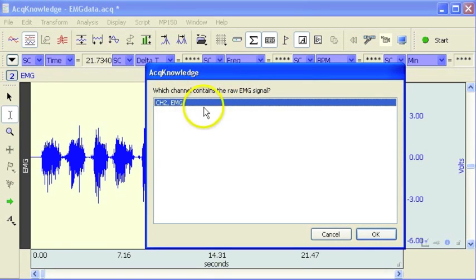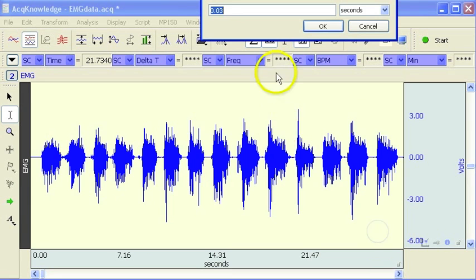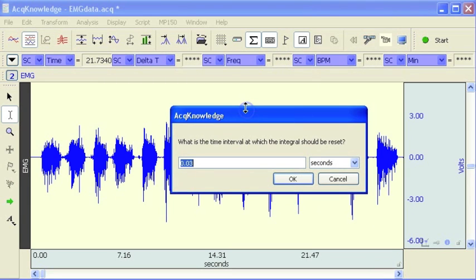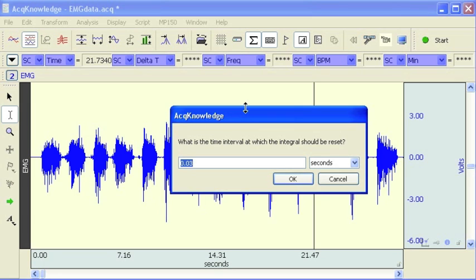Once we've selected our waveform, we're going to be asked to enter a time window. This time window is going to instruct the integrator to reset itself.